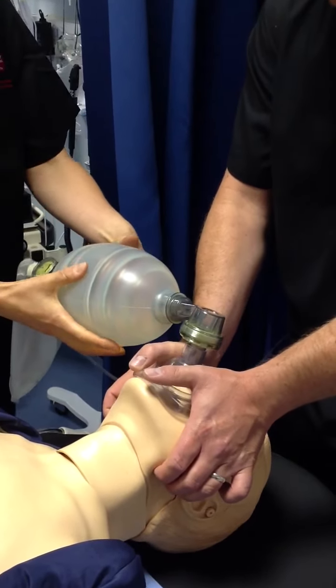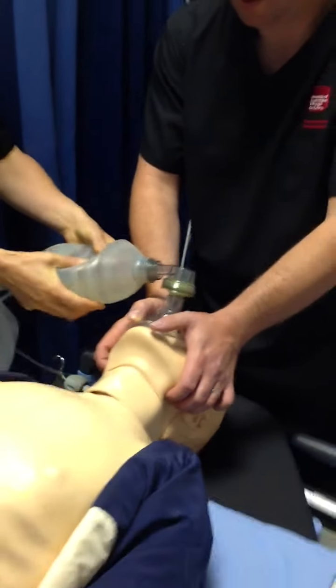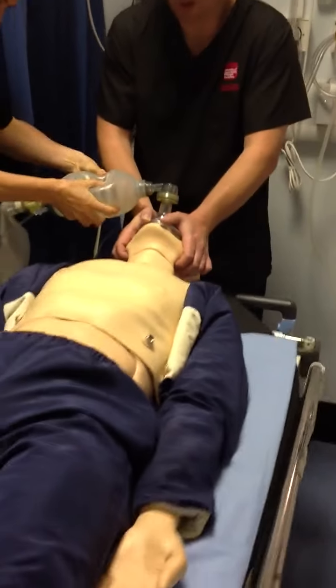And then, of course, you would provide a breath — just enough to ensure a chest rise.